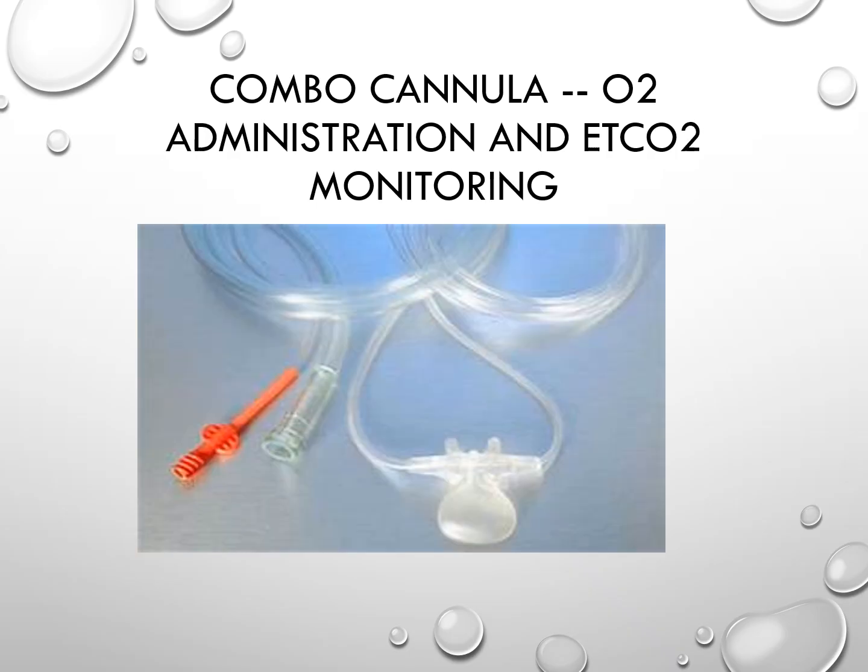Now, this particular device is a combination. It's both therapeutic and diagnostic. It's a nasal cannula that can deliver oxygen, as all nasal cannulas do, but at the same time, it can also monitor end-tidal CO2. They're extraordinarily useful.